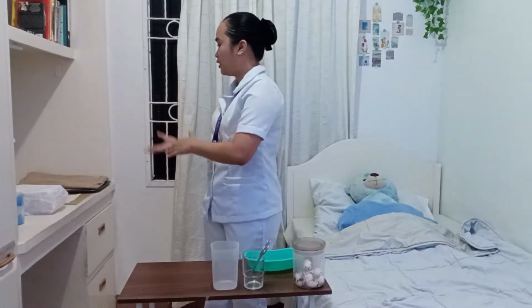After thorough hand washing, I have prepared the necessary equipment needed to conserve time and energy. So I have here a bath blanket, a light, sterile forceps, cotton ball soaked with betadine, a catheter set which includes sterile glove, absorbent pads, an eye sheet, specimen container, a lubricant, 15 to 20 cc syringe with 10 to 15 cc sterile water, a Foley catheter, urine bag, and a catheter tape.